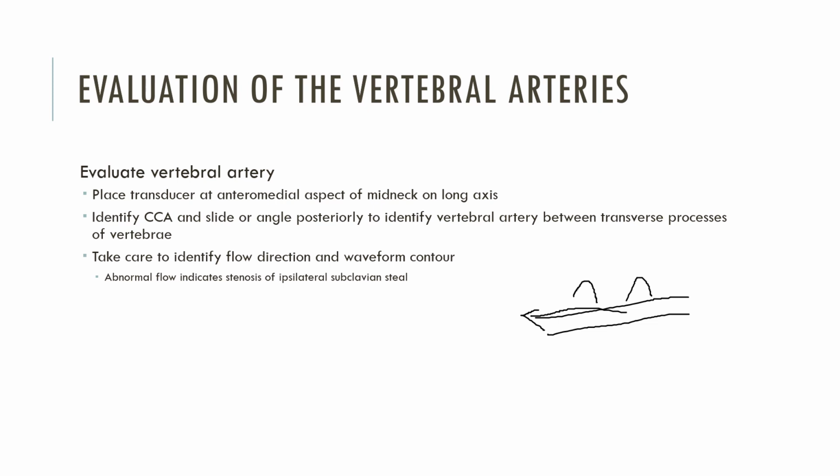the head. So if I had red towards, blue away on my scale, and I had my color box set at this particular angle, if the blood were flowing towards my head, it would be going this direction and would appear red. My scan lines are coming this direction, so my blood flow would crash into those scan lines, not run from them, and that would cause a positive Doppler shift, and it would appear red on my image.